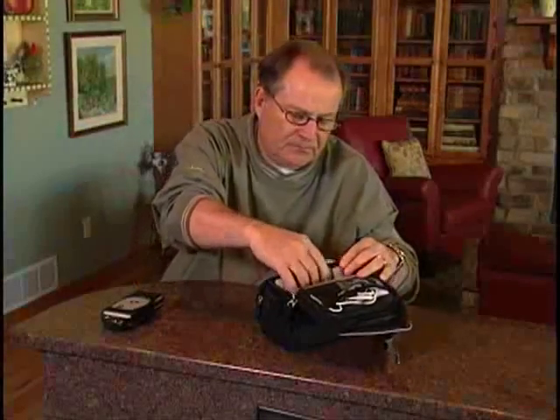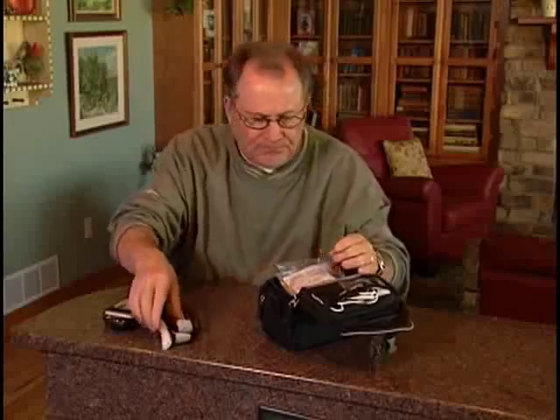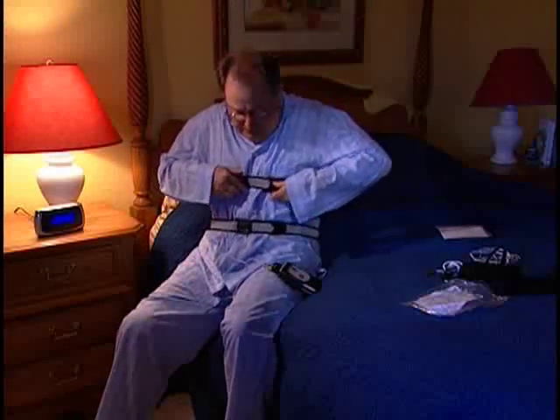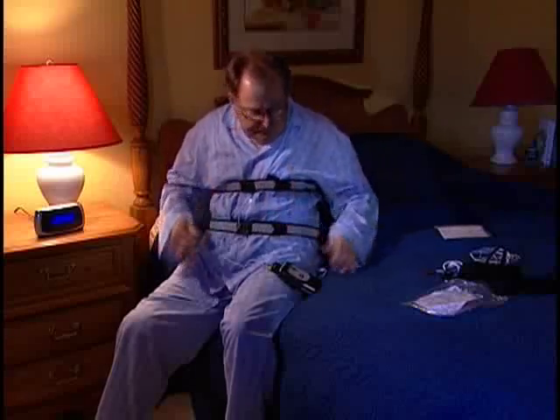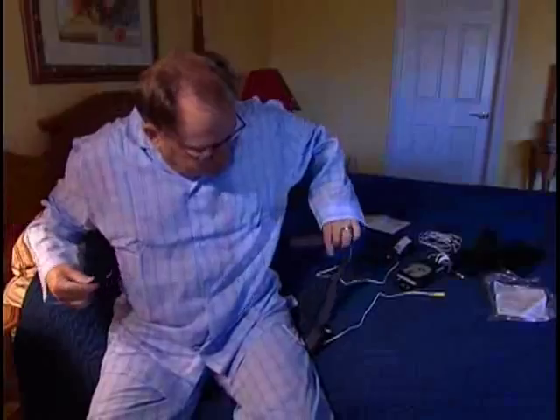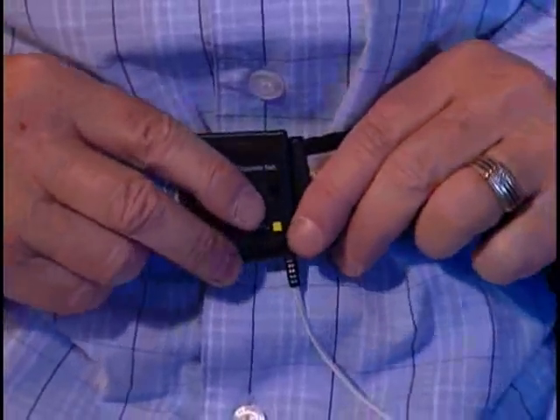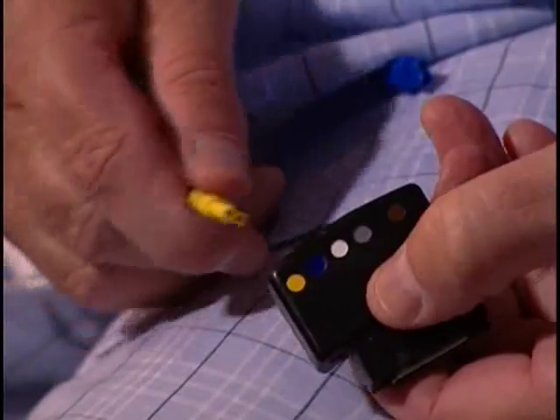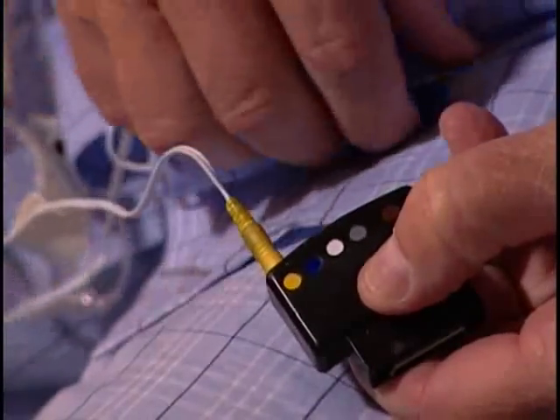Your clinician may have given you 1 or 2 respiratory effort belts. These belts are intended to be worn over your night clothes, not directly on skin surface. Locate the yellow labeled Abdomen Exact Trace Respiratory Effort Belt. Place this belt strap with the label connection facing away from your body around your abdomen. Center it just above your waistline and connect the belt around your body as shown. Plug the yellow tip into the yellow sensor input on the sensor proxy.